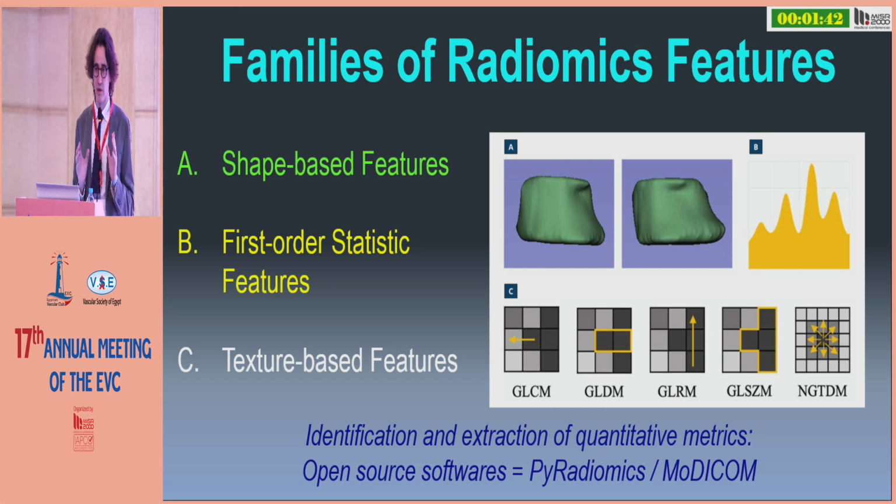This is a more complex thing to imagine because we are not used to thinking in this way. Texture-based features look, for example, you see GLCM, GLDM, GLRLM. Each one of them is a feature that you can ask the software to run through your images. And they can look, for example, at the relationship between couples of voxel or pixel, depending on what imaging you're using, and to compare them with the couple next to them. You can see how many gray voxel or pixel are present within the same matrix with the same grayscale.